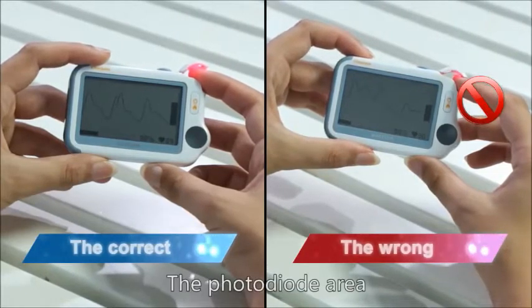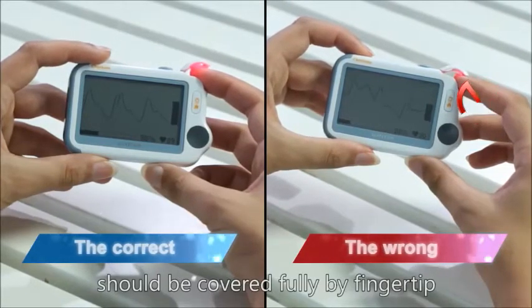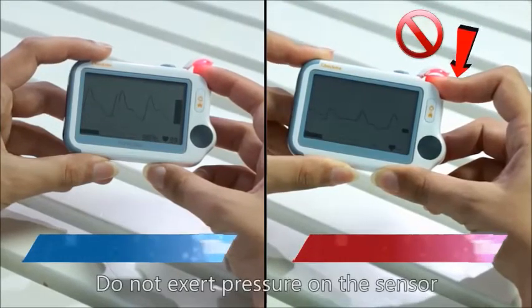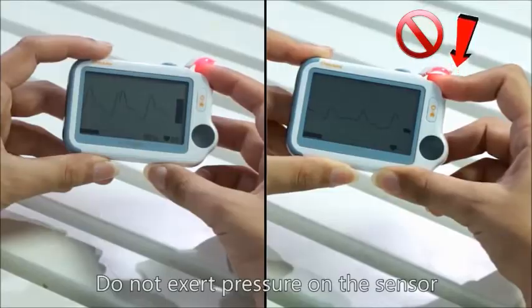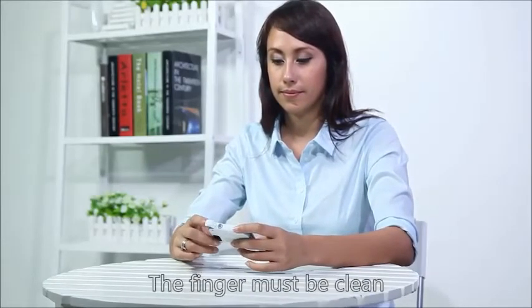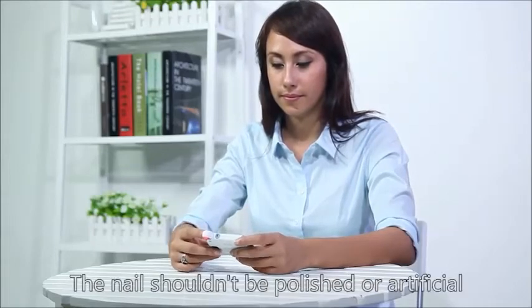The photodiode area should be covered fully by the fingertip. When measuring, keep your finger relaxed. Do not exert pressure on the sensor. Pay attention to the status of the finger for measuring. The finger must be clean. The nail shouldn't be polished or artificial.